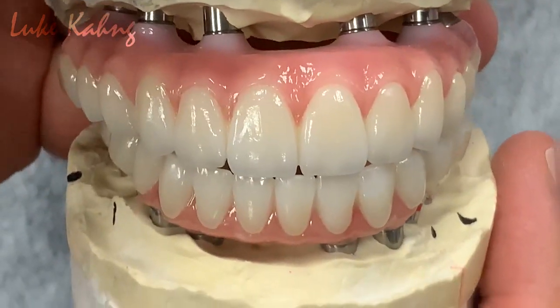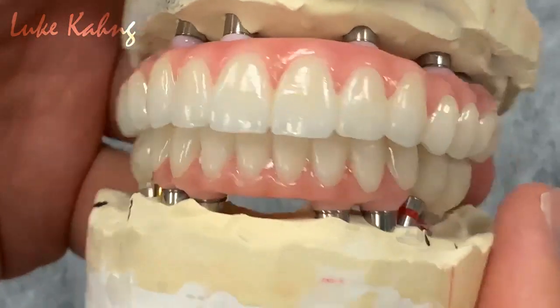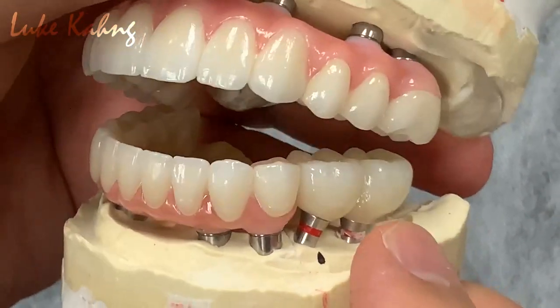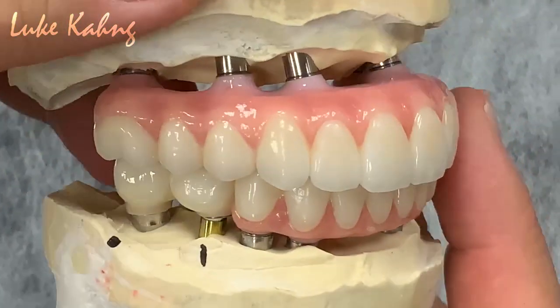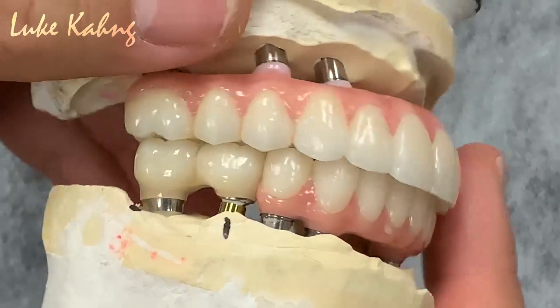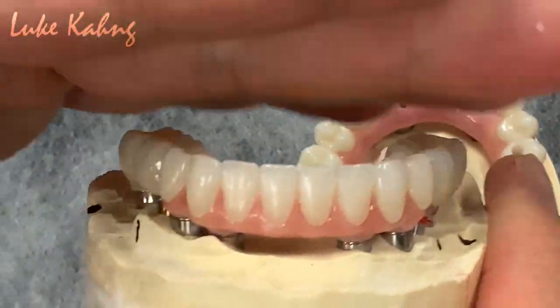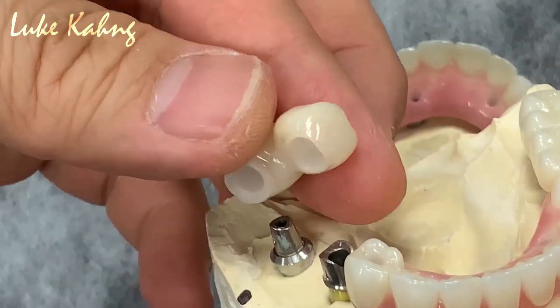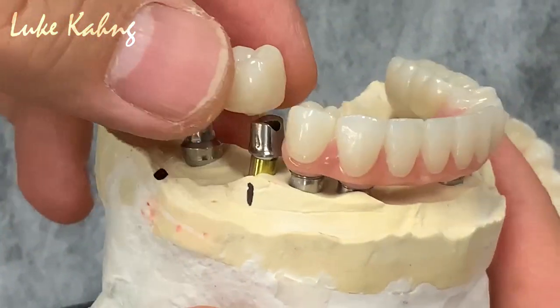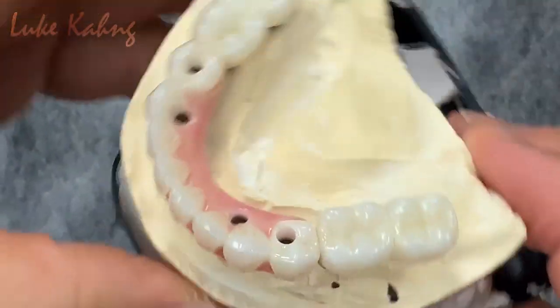Alright, it's almost done. We go. Excellent aesthetics. The finish it with the highest aesthetic. The back tooth is more pink. Interior is 8 unit. And this one is finished. I only put the one screw here. So I'm going to take it out this. So this is 2 unit. So we're going to anodize it here. Looks good.